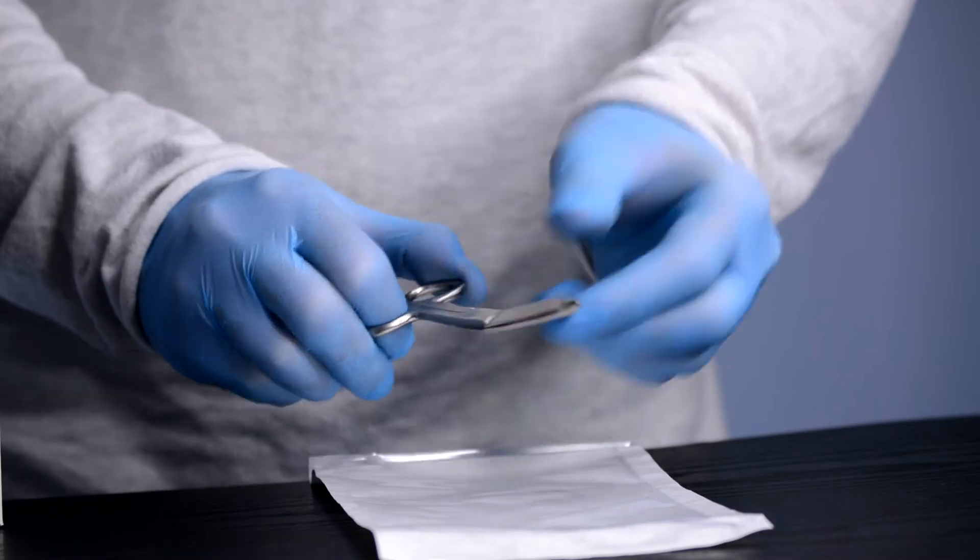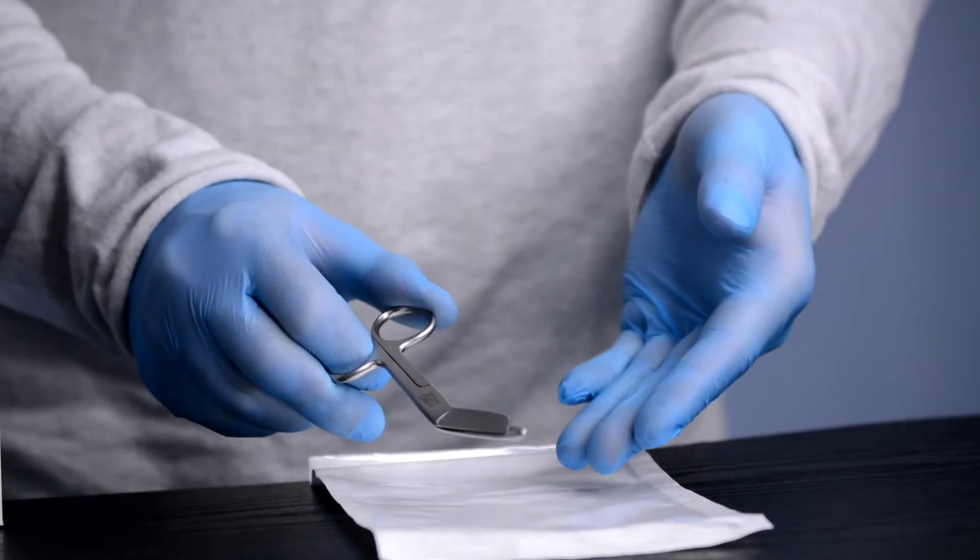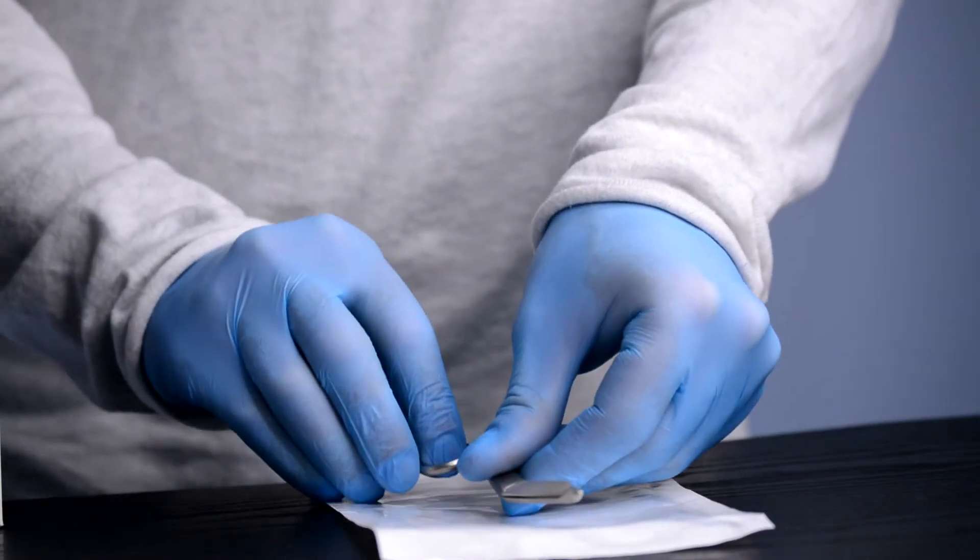They are available in boxes of 10 and each scissor is individually wrapped, sterile and ready to use.